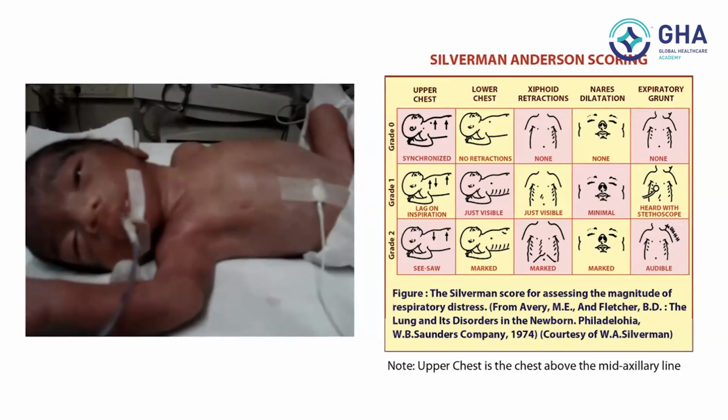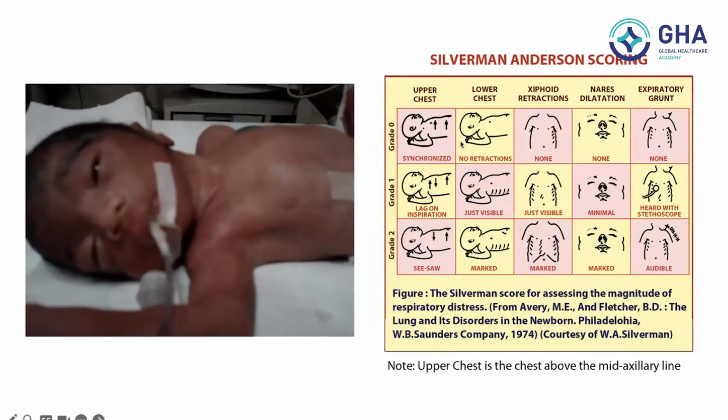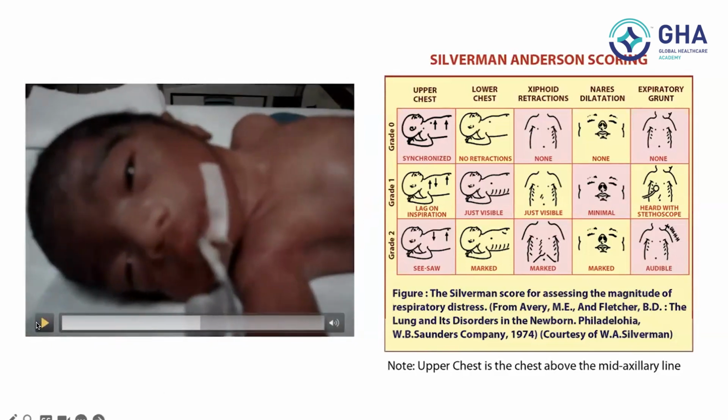So you have a significant respiratory score in this baby, saying that the baby has very increased work of breathing. Fortunately, in newborns, this high score is a marker that his alveoli are collapsed and his FRC is low. So we need to do something to open up these alveoli, and the best way to do it is by giving some positive pressure through the nose.